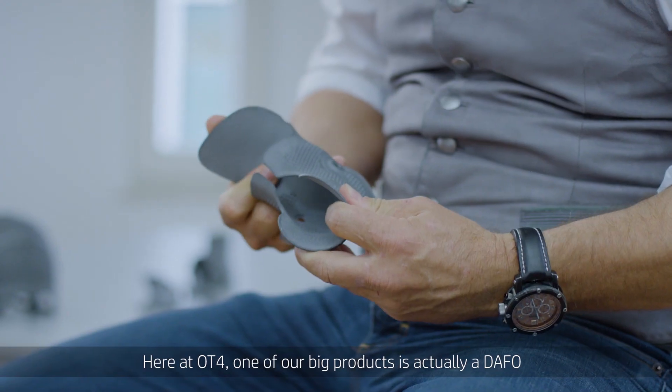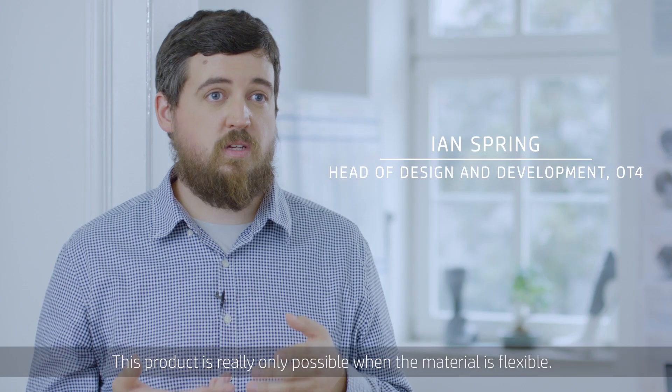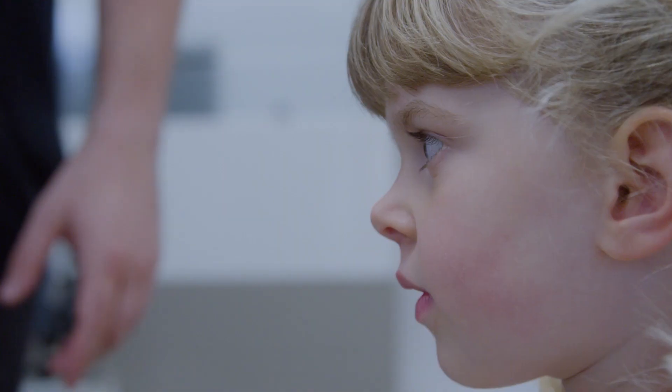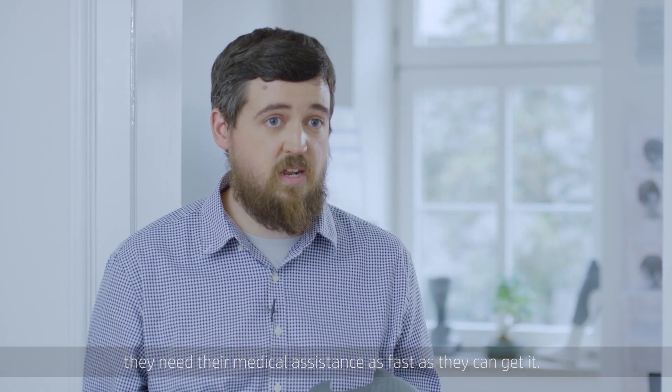Here at OT4, one of our big products is actually a DAFO, which is a small foot orthosis that goes on to children. This product is really only possible when the material is flexible. When a patient is coming freshly operated out of a hospital, they need their medical assistance as fast as they can get it.